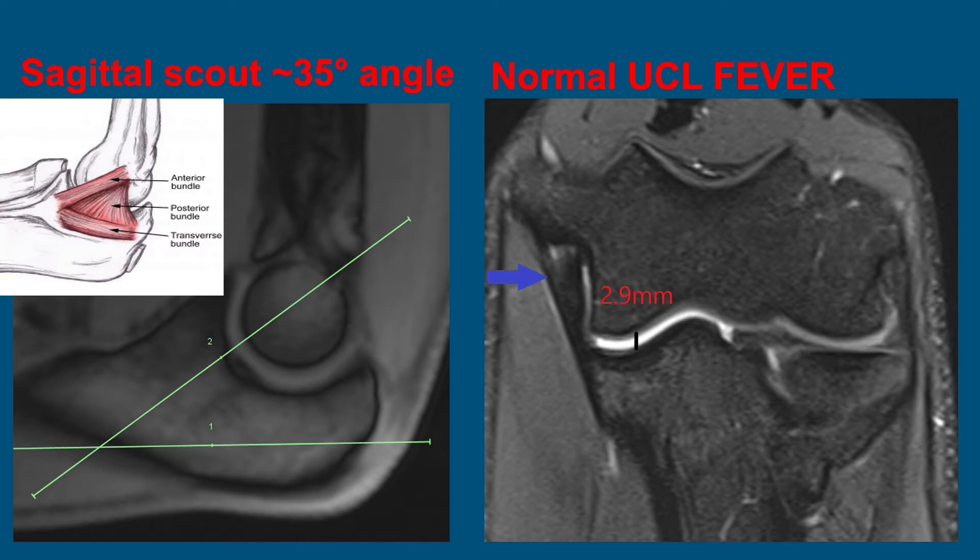Here's an example of the MRI FEVER view. On the left is the scout localizer sagittal image where we plan the coronal plane, using about a 30 to 35 degree angle from horizontal, which approximates the interbundle fiber distribution. On the right we see a normal UCL FEVER coronal PDFS image showing the long axis of the normal UCL and a 2.9 millimeter ulnotrochlear joint space.